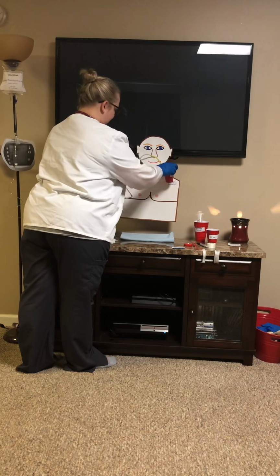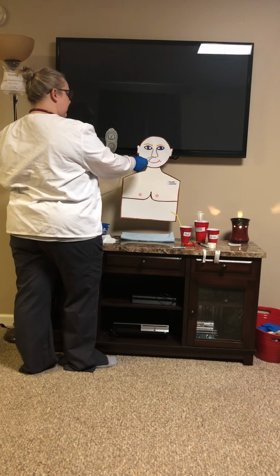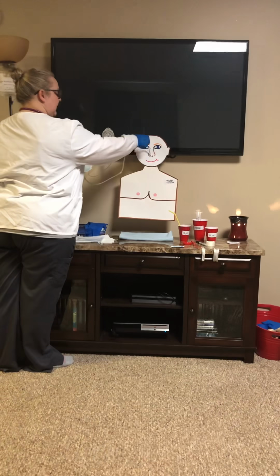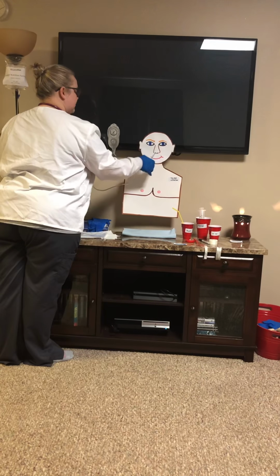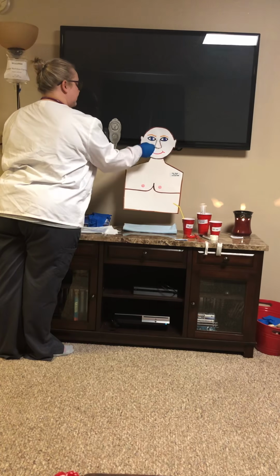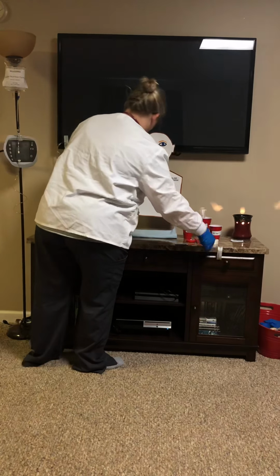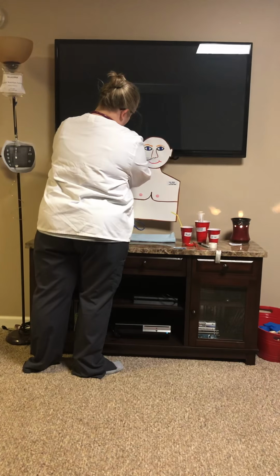He does have his drinking water. As he drinks, I'm going to insert the tube 1 to 2 inches each drink. And as he coughs, I'm going to instruct him to tilt his head towards his chin. I'm going to progress the tube. Drink, drink, drink, drink, drink, drink, drink, drink until my marked area. I'm going to temporarily tape this to his cheek.